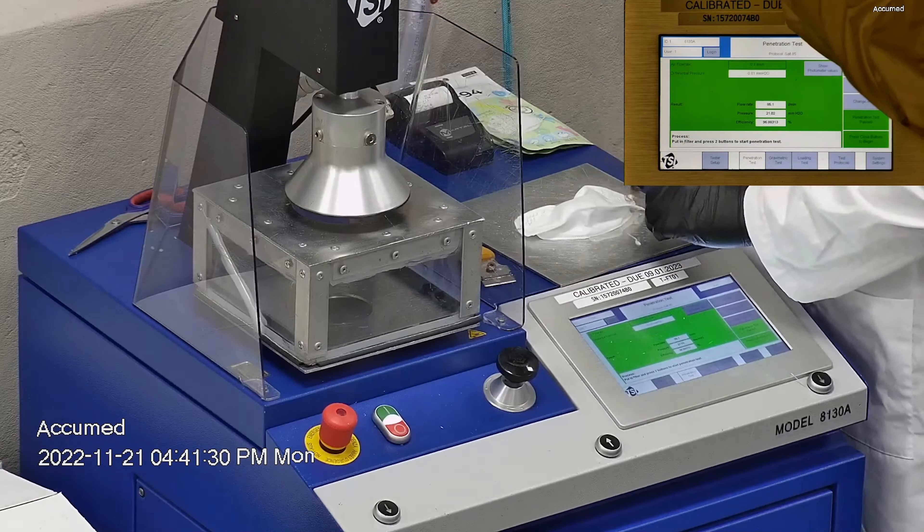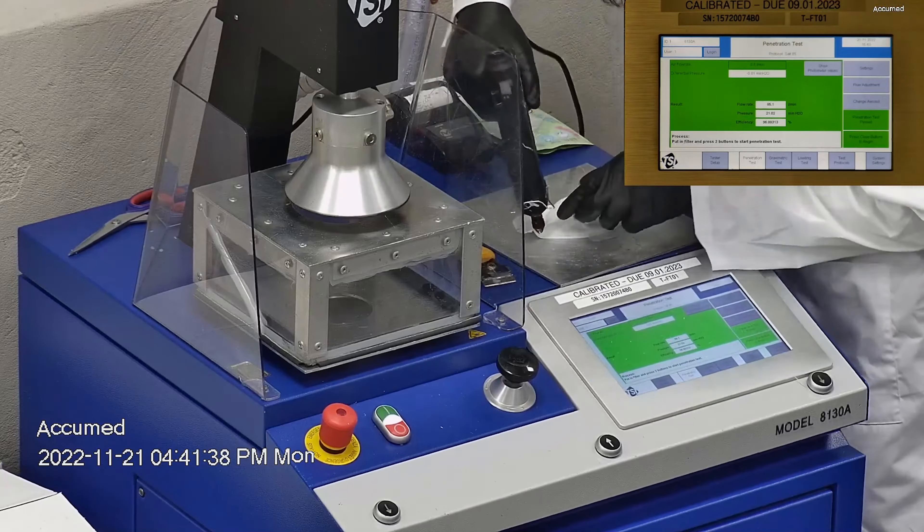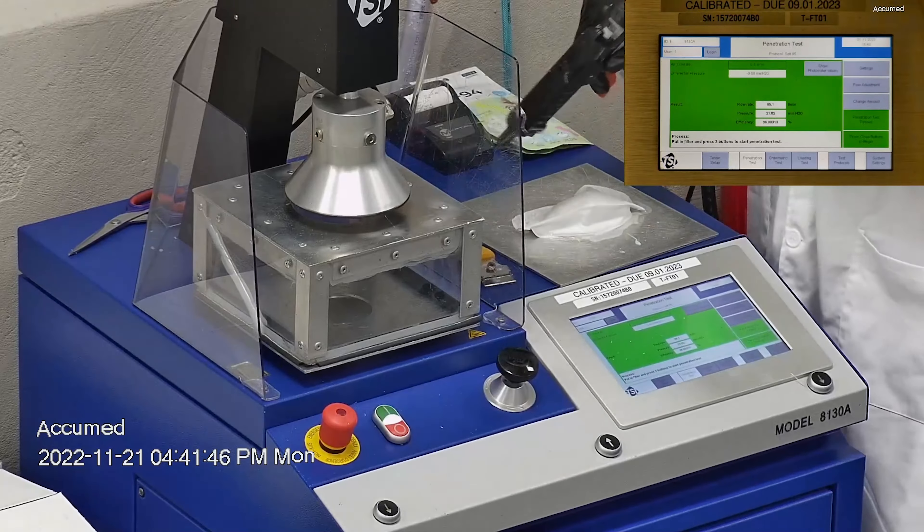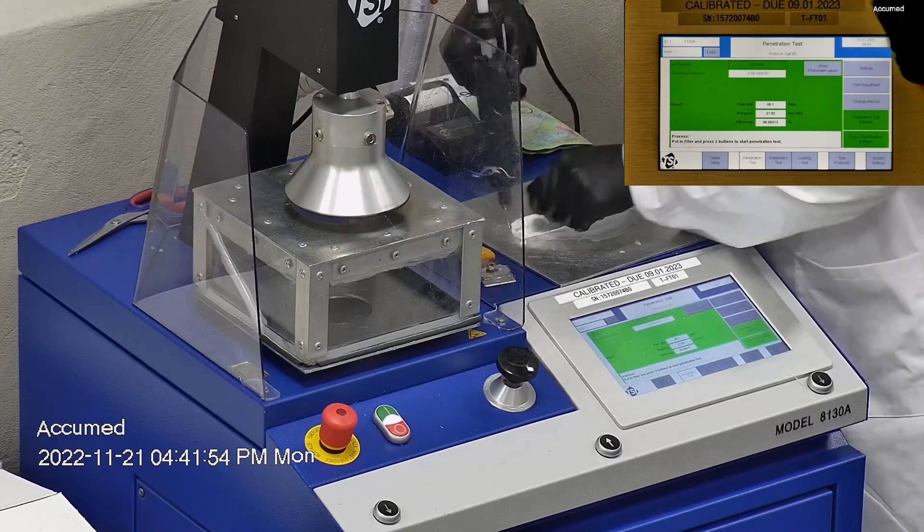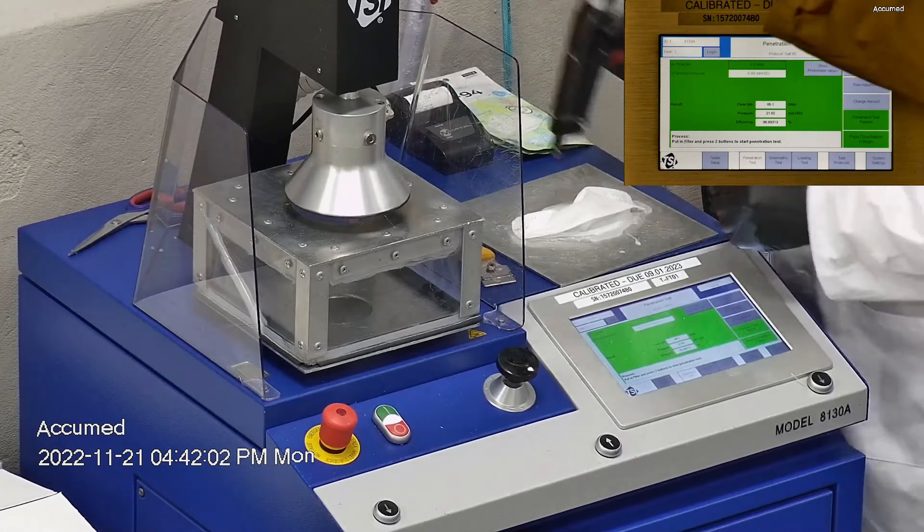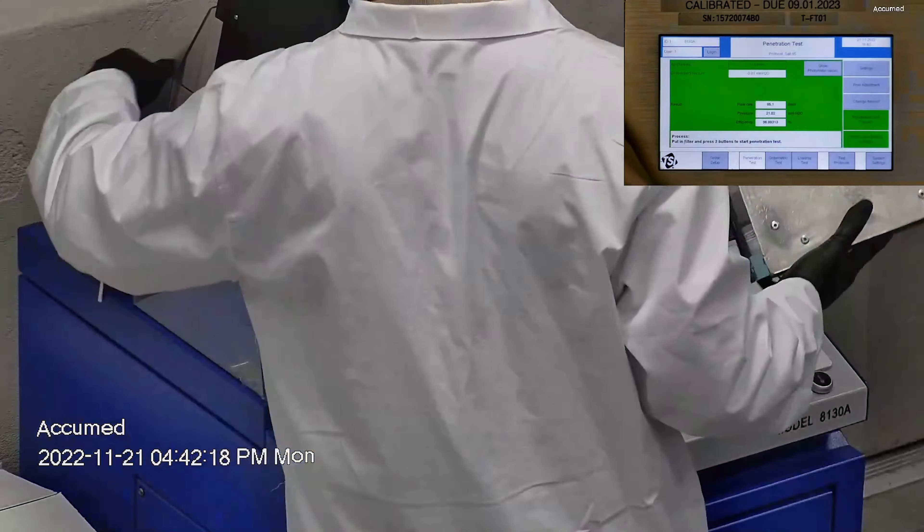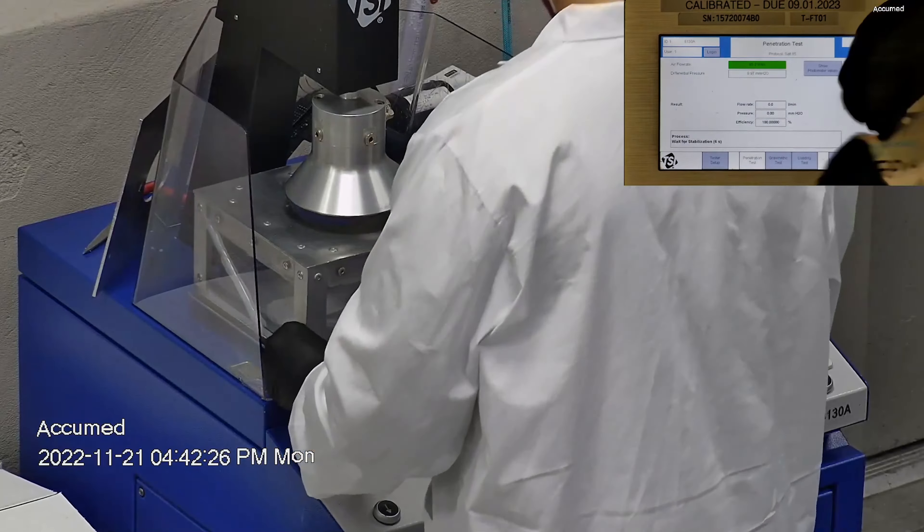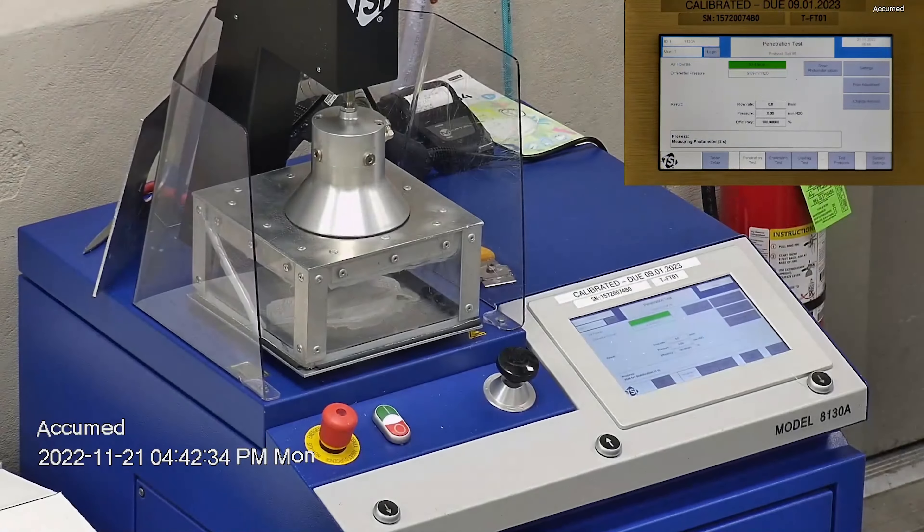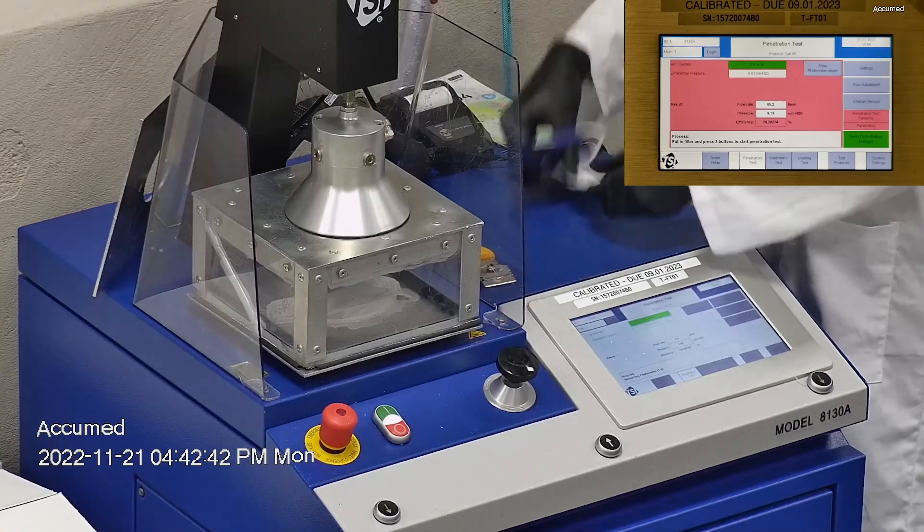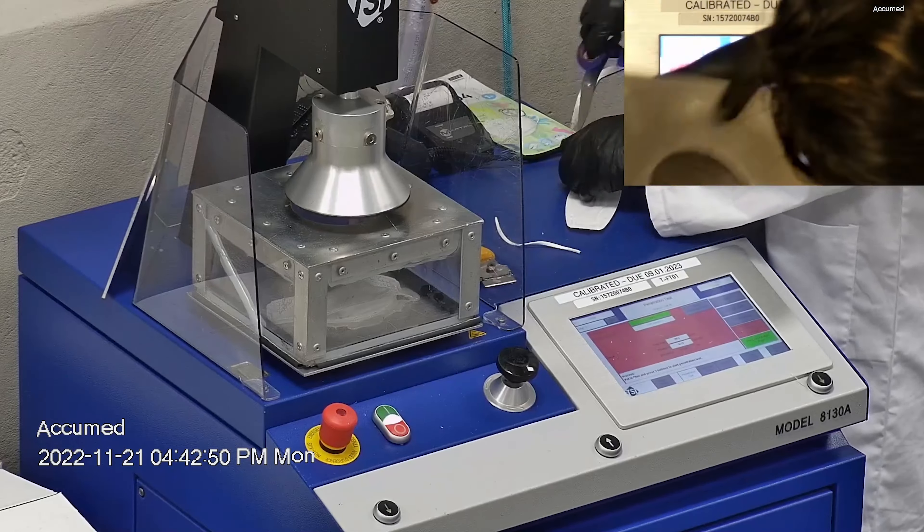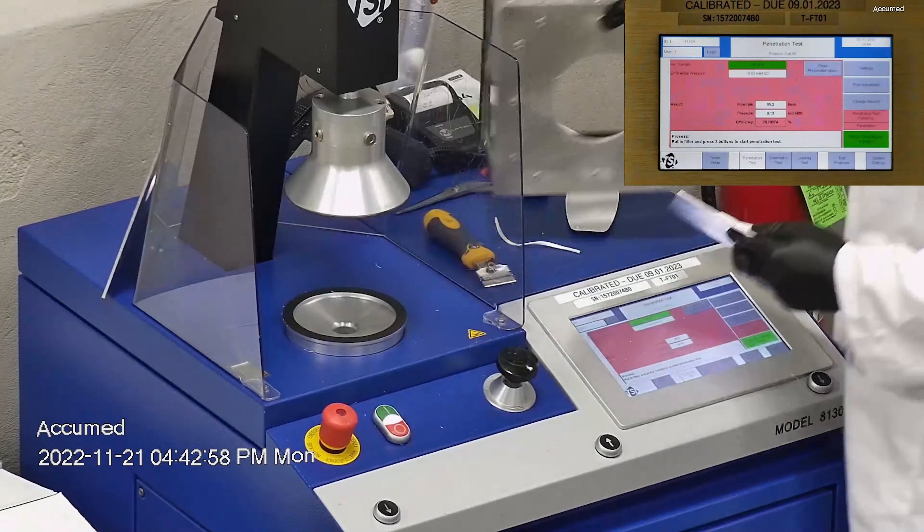Then we make sure that the mask is properly and completely sealed with hot glue to the testing plate. When applying the hot melt glue, we make sure that there are no holes or leakage around the seal to ensure accurate results. The testing plate is then attached to the frame and the box is placed under the TSI filter holder for testing.